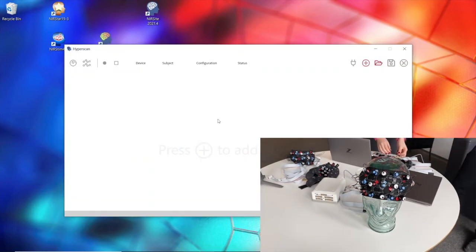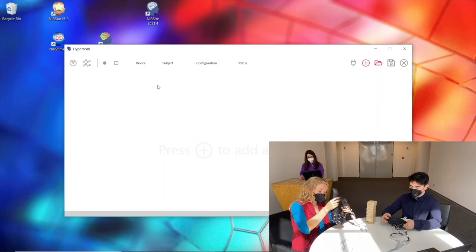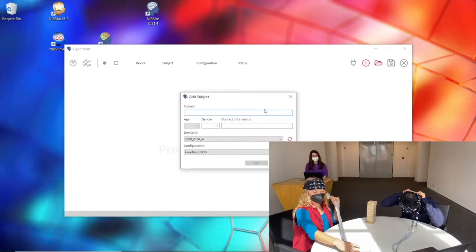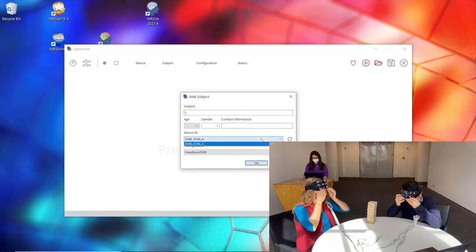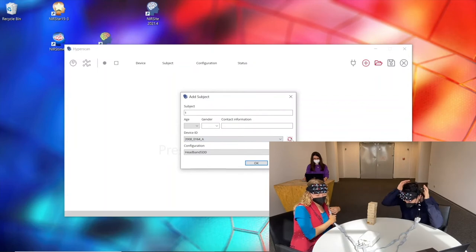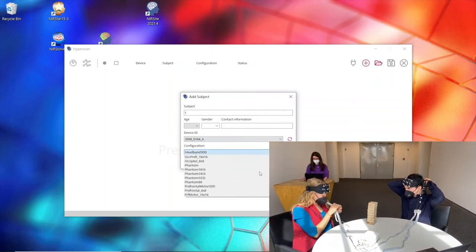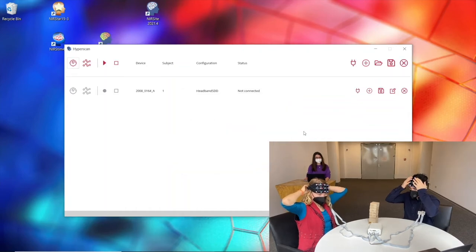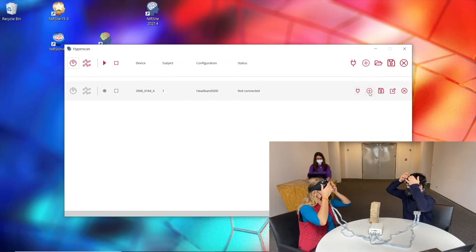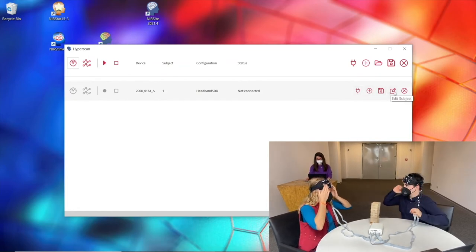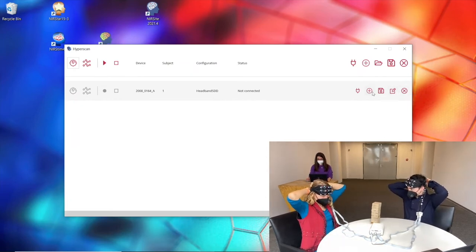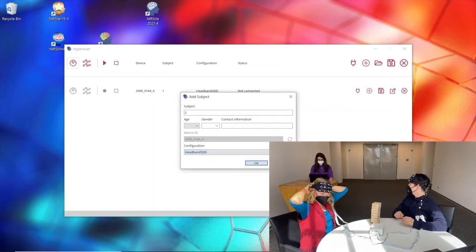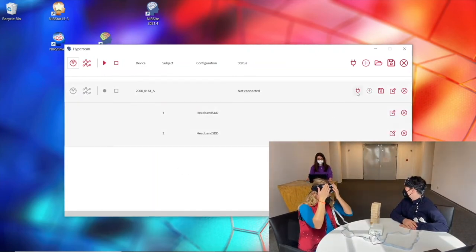In the demo, I started from the point where I had already prepared my configuration, then launched the Hyperscan application. I added the first subject with the device serial number found in my computer's Wi-Fi connections and selected the headband with short-distance detectors configuration. Then I added the second subject to the same device — the device ID was grayed out, but I selected the same headband configuration. After pressing initialize, the Hyperscan app launched two different instances of Aurora in the background. I then pressed the calibration button for both subjects simultaneously.